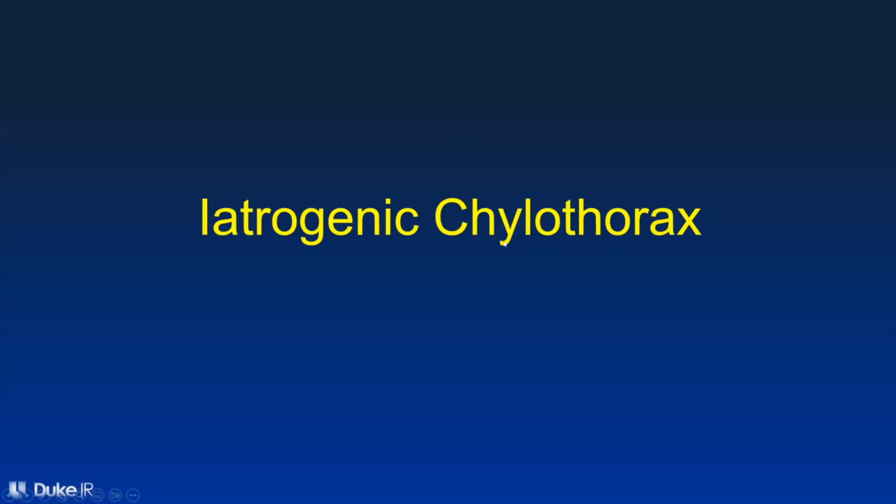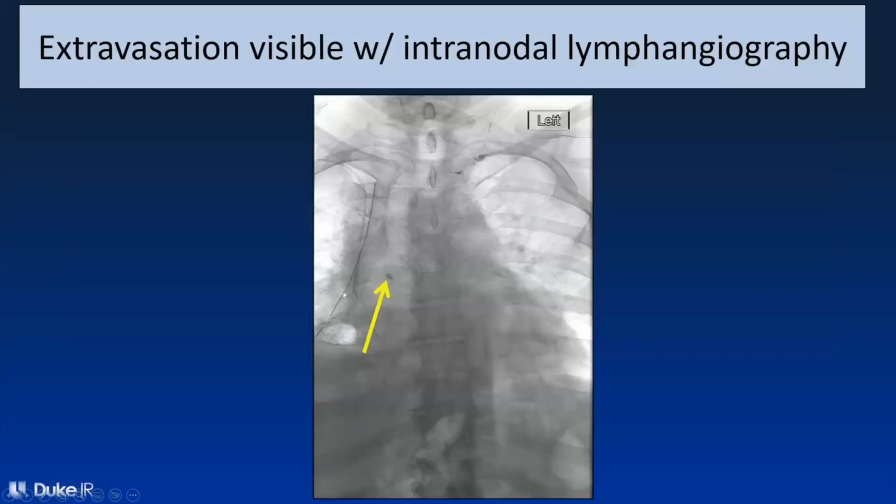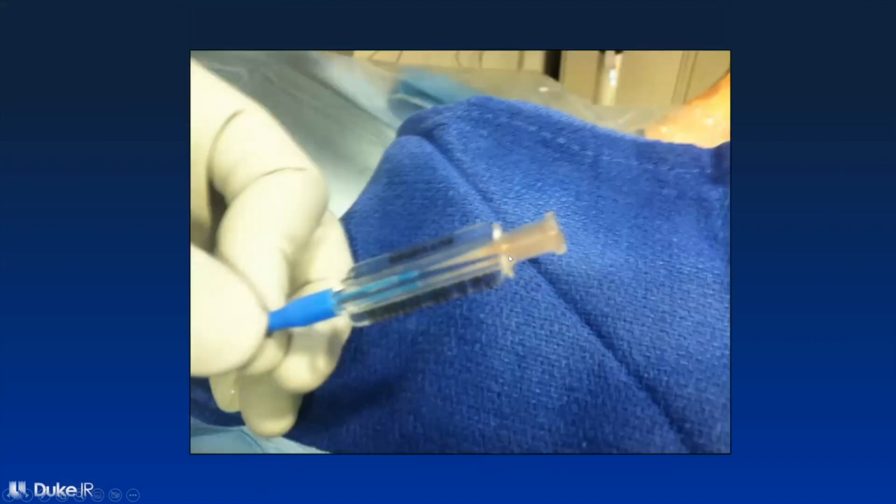One is chylothorax, when patients have a lymphatic leakage in the chest. And this case is a patient who had mesothelioma, underwent surgery, pleurectomy and decortication by cardiothoracic surgery, and developed a lymphatic leak on the right side of the chest. We did the lymphangiogram, we identified the leak, and here we are accessing the cisterna chyli, and we're advancing wires and catheters up the cisterna chyli.